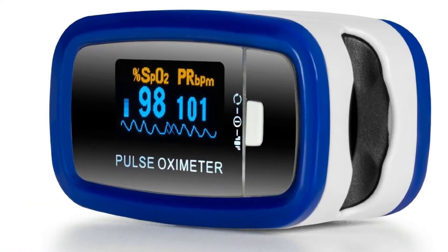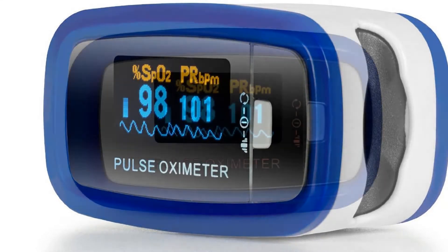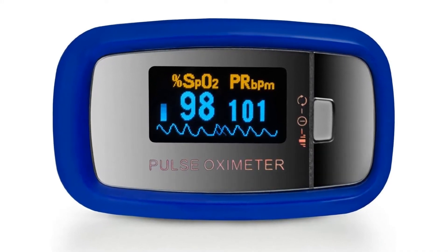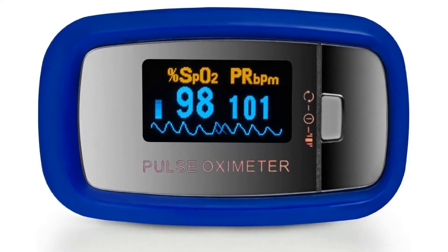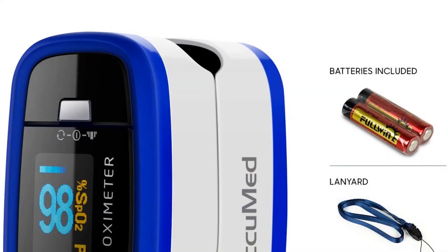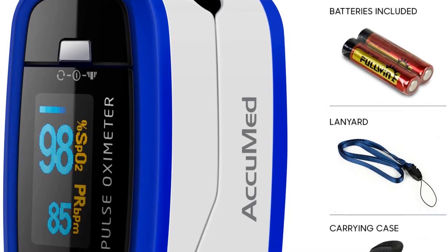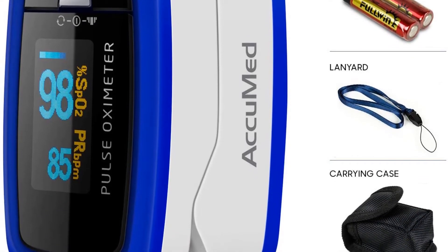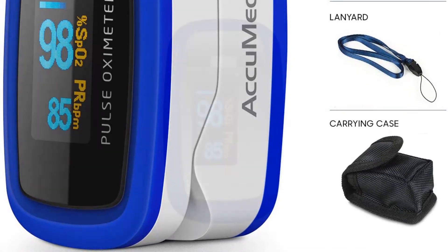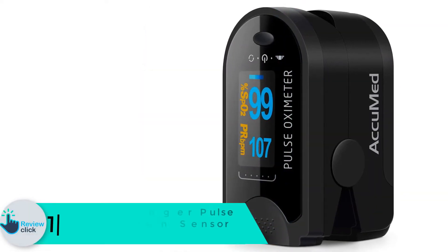At number 2 we have the Acumed CMS50D One Finger Pulse Oximeter Blood Oxygen Sensor SpO2. It's now easy to get correct oxygen level readings without going to a laboratory, whether at home or outdoors. This Acumed oximeter is high performing and accurate, delivering results in a blink of an eye. It detects blood oxygen saturation and heart rate, fits different sized fingers, and features a high-resolution crystal clear screen for easy reading, delivering 20 continuous hours of use.